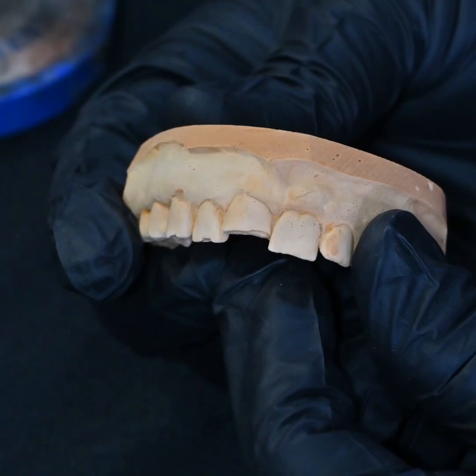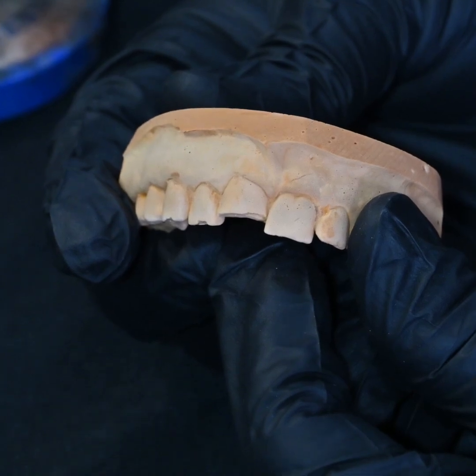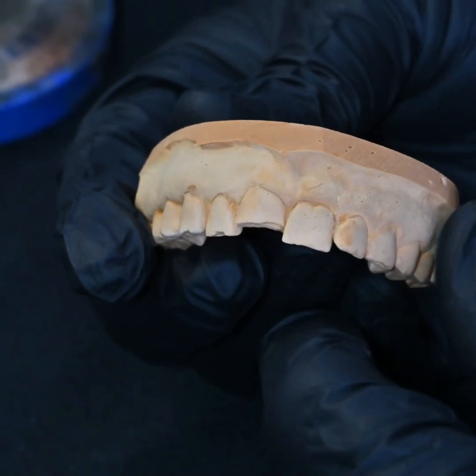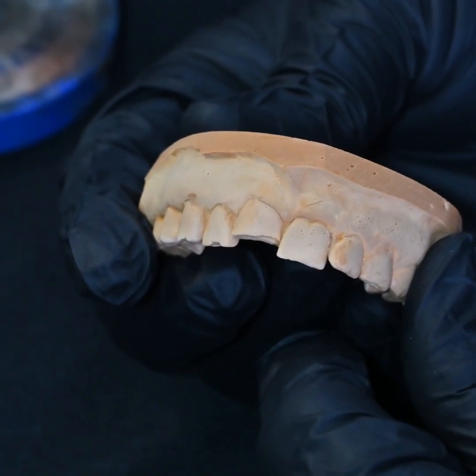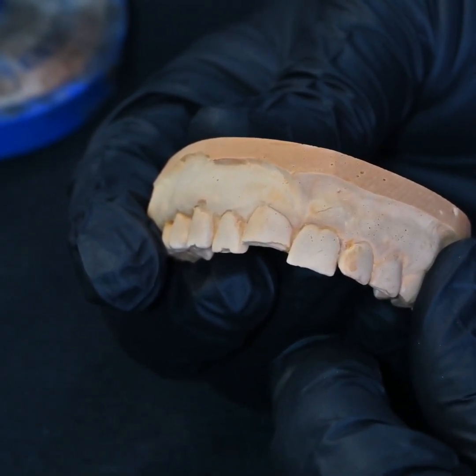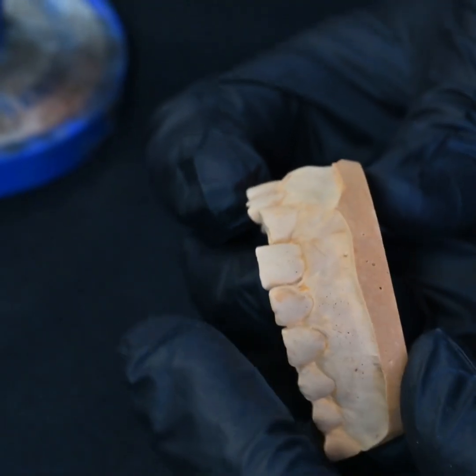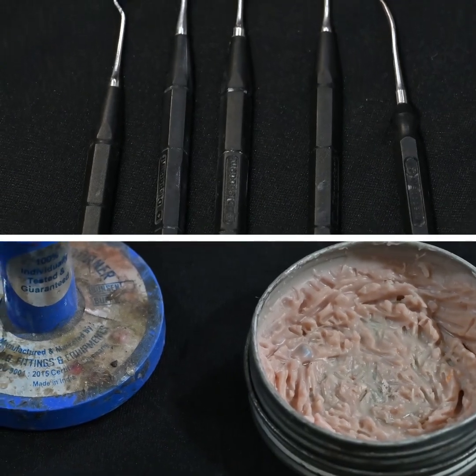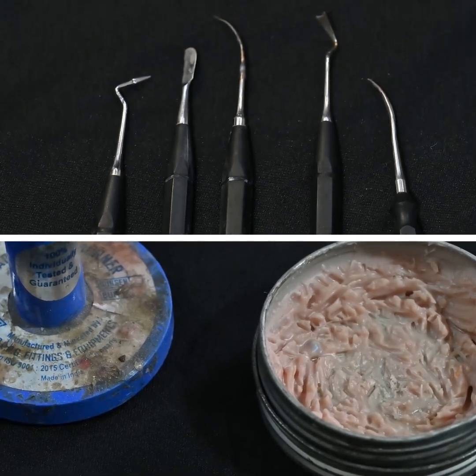Hi guys, this is Dr. Aakash and this is our tutorial for how to do a mock-up. A lot of you have been waiting for this day. This is a case where we are rehabilitating a central incisor by doing a direct anterior composite. We are going to use a pati shell technique wherein we have to first do a mock-up, with the help of the PKT instruments and the mock-up wax.